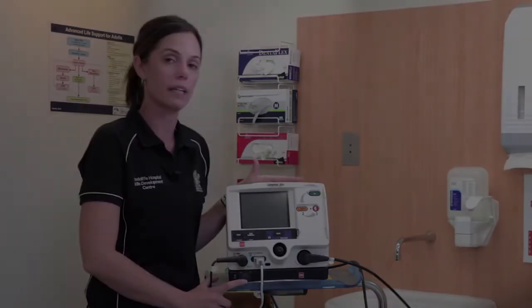Hi, my name is Kelly, your simulation coordinator, and today I'm going to walk you through defibrillation safety and its functions using the LifePak 20E.